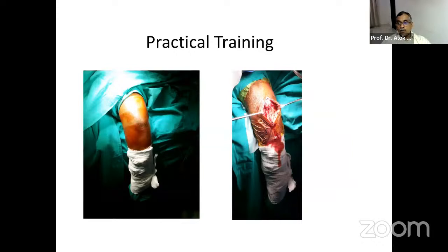So let us see, how do we go about the surgery? As we discussed, the patient lies with the arm hanging, supported at the elbow. You give an incision, going radial side to the olecranon. You go straight deep without superficial dissection. You can identify the fracture. You can identify the ulna. You assess the distance beyond the coronoid process to make a drill hole here.